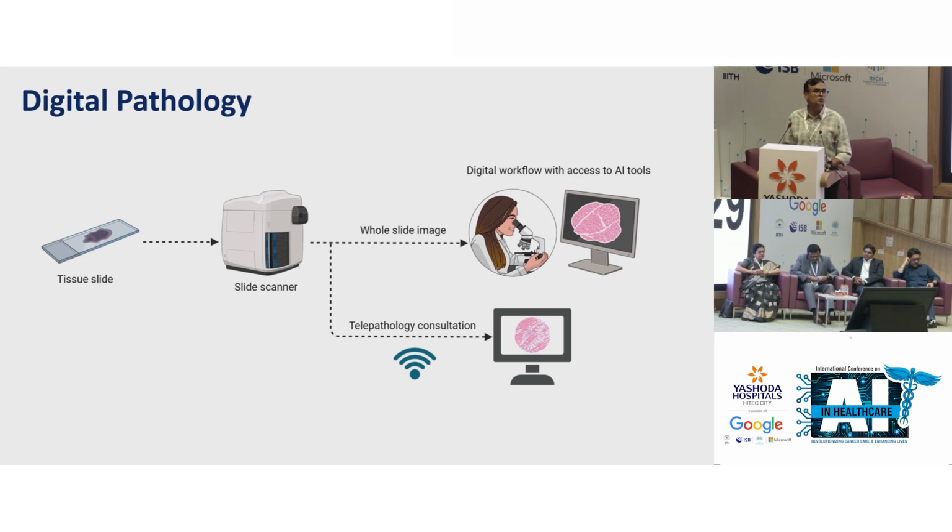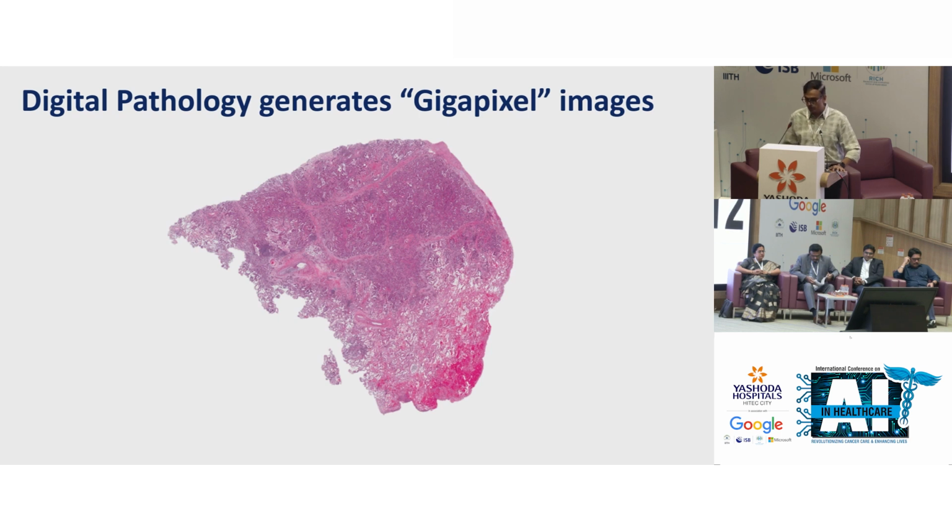Therefore, we started investing some resources in digitalizing the whole slide images that are in the archival materials of the institutes. What is interesting is that once you digitalize these images, you get what you see on the screen, called a gigapixel resolution image, which is not like the image you take on your phone camera, and it has a lot more information than you could see with your eye. This is where you have to appreciate the pathologists who do this job day in and day out, looking for a needle in a haystack, right?